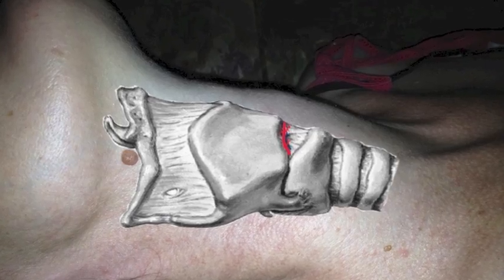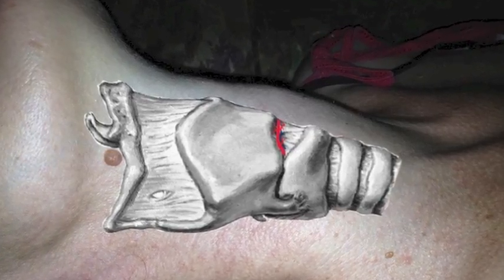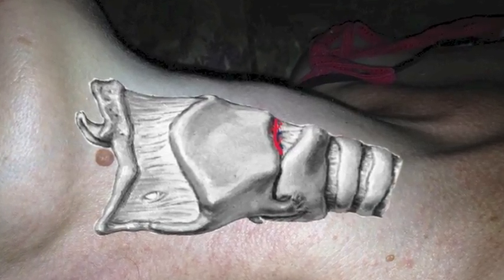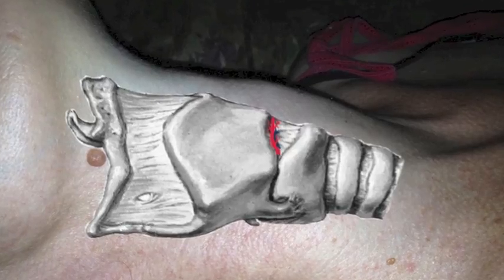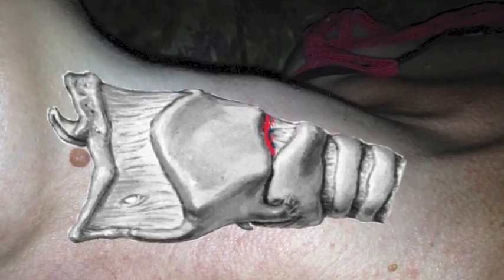The vascular structures are along the superior edge, so the recommended entry point is the lower border of the membrane.